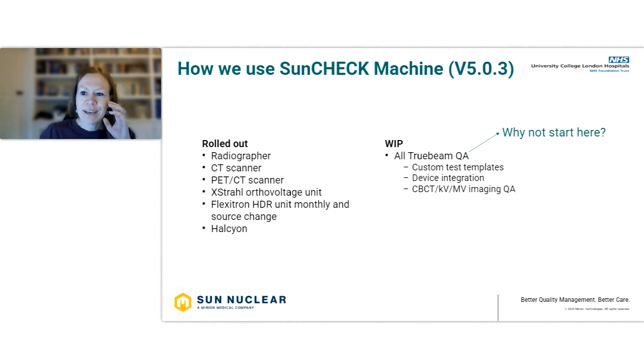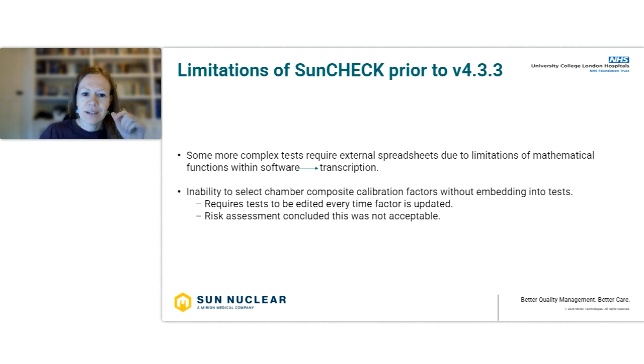But when we started with SunCHECK, this was prior to version 4.3, so there were some limitations to the software back then, in that there were some tests like measuring DLG where we needed to plot and fit graphs, and that functionality wasn't quite there within SunCHECK, so we'd need to use an external spreadsheet and then transcribe data back into SunCHECK, therefore risking transcription errors. We now have that feature in SunCHECK, and Corey's going to talk about that later.